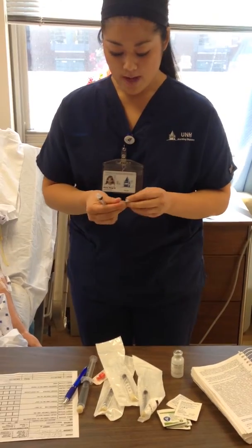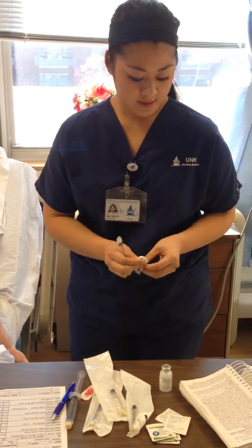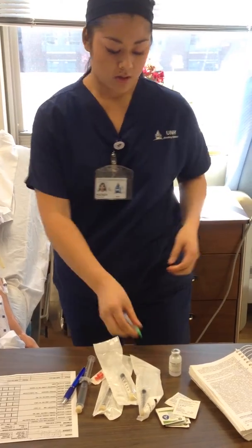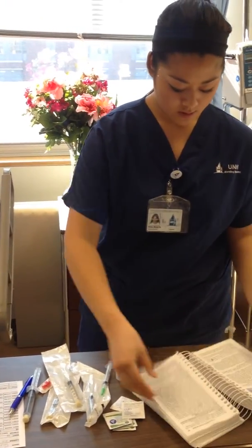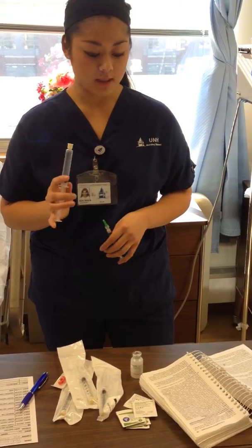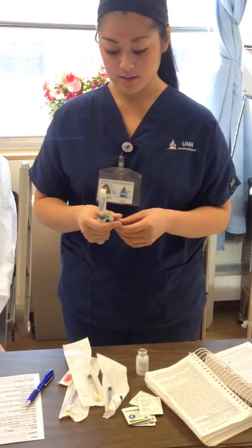So we're going to drop our med. If you don't know about hydromorphone, you just use the drug book in the room. And we have a dilution rate of 5 milliliters normal saline, and we have a rate of administration over 2 to 3 minutes.